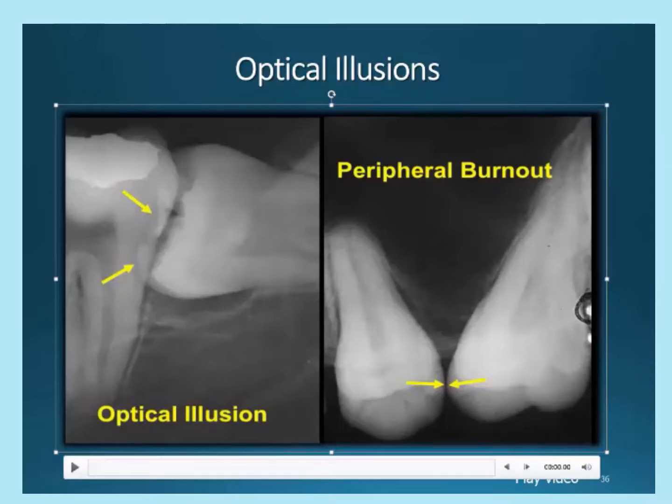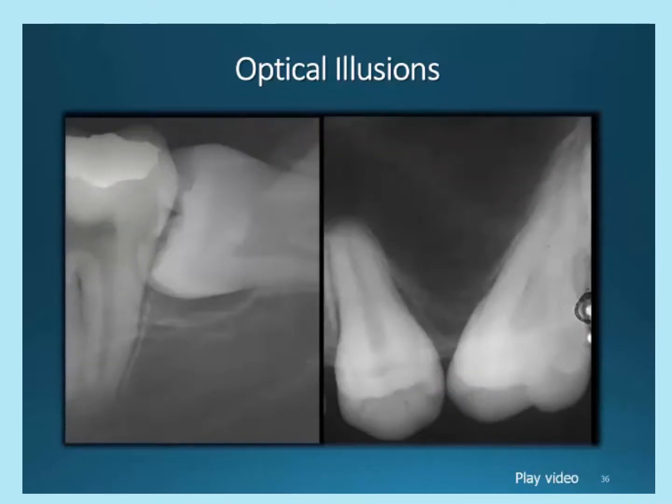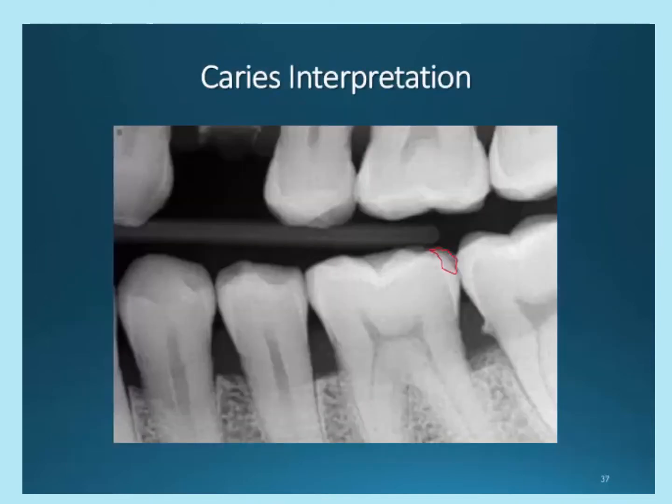Good. I think this kind of helps you, these videos. They are very informative. Okay, we'll move into an area now of caries interpretation and documentation. All visible decay must be documented in the patient's chart. Let's practice now how these lesions are drawn to accurately display their condition.